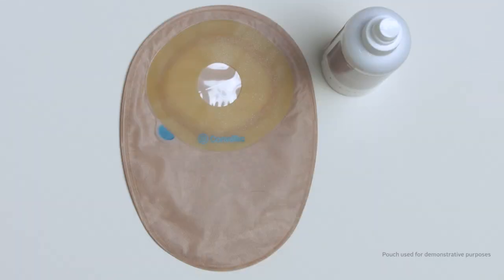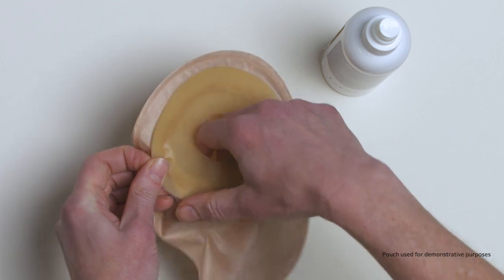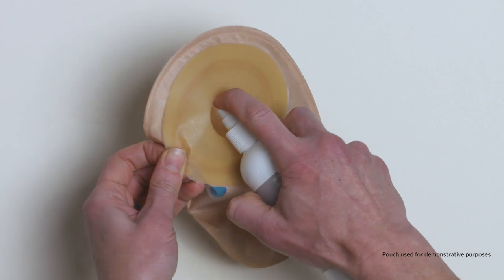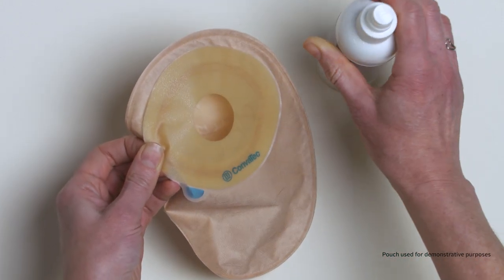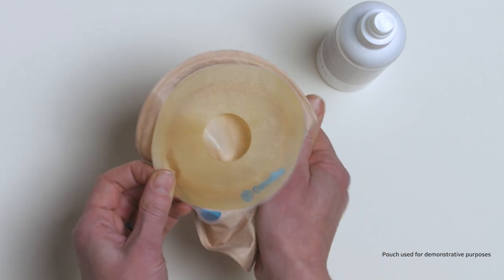To apply the lubricant before ostomy pouch application, place the pump spray nozzle near the ostomy bag opening. Spray the product down into the pouch three to five times. Rub your pouch between your hands to ensure the lubricating deodorant has coated all parts of the pouch.